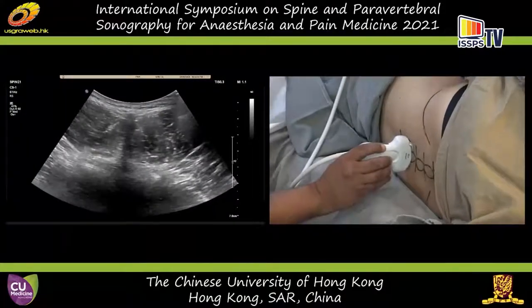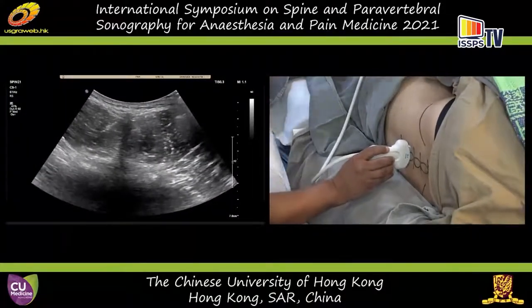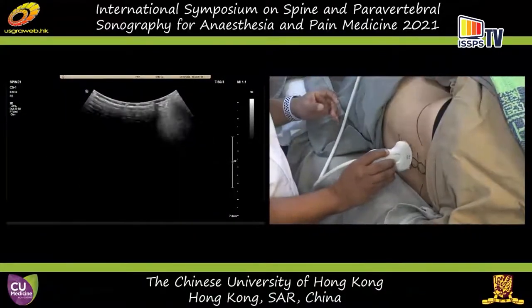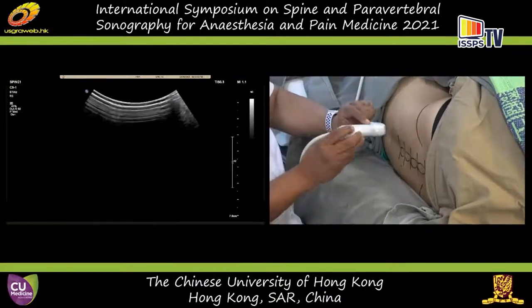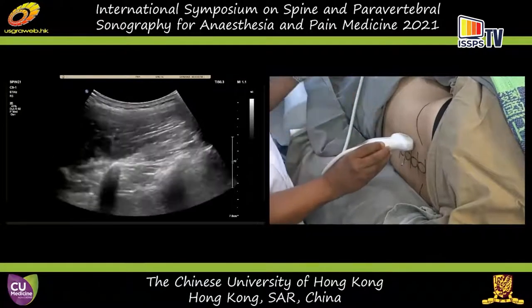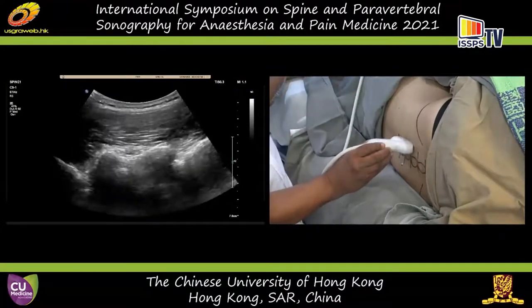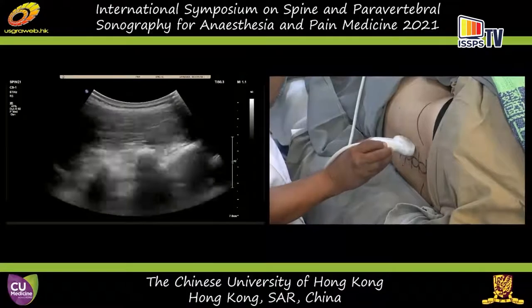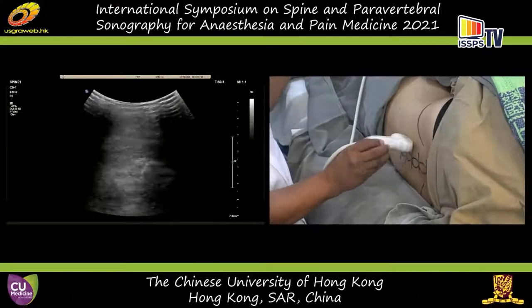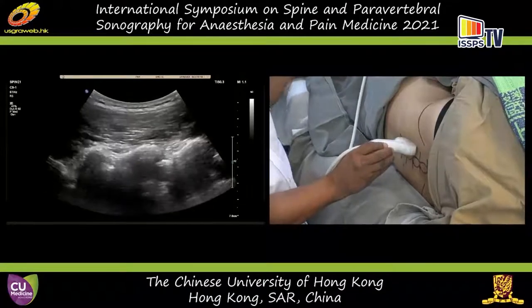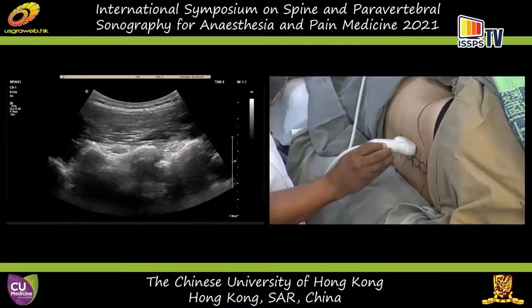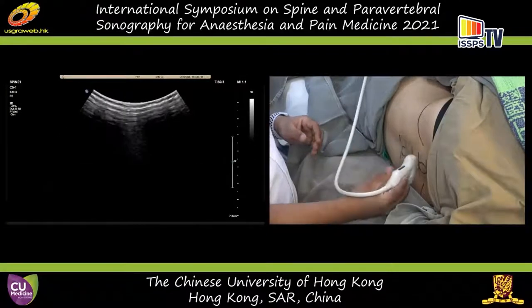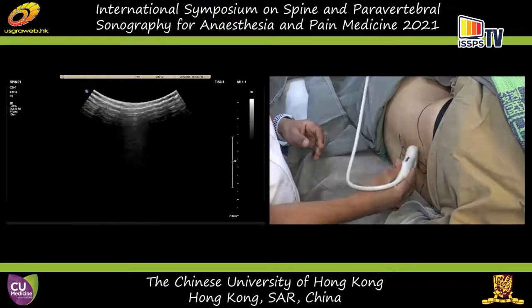This is the head end; this is the back end. When I do a sagittal scan, the orientation might be pointing towards the head of the patient. So whenever you see a sagittal view, that will be the head end. When you see a transverse view, it will be the right side of the patient.